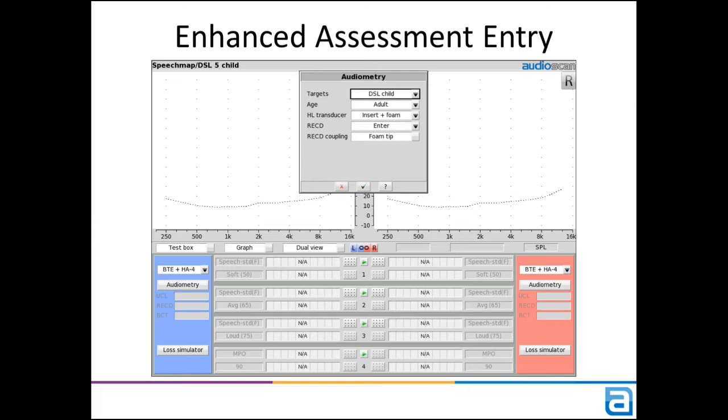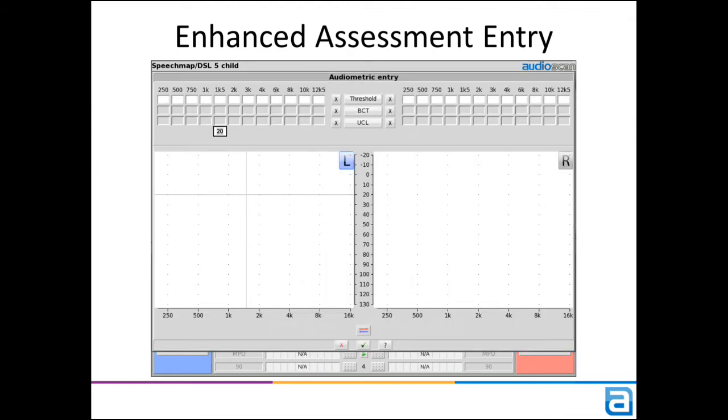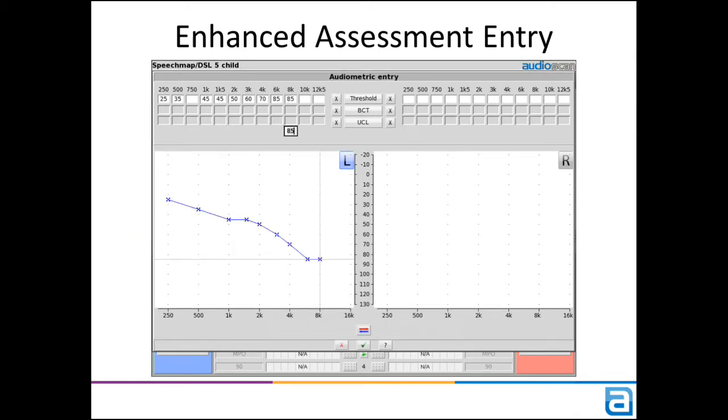However, when you click on the Continue button, you're presented with a new dual view entry screen. Click in the graph to enter an audiogram. Note that once data has been entered for one ear, this Copy button at the bottom is activated. Clicking this will copy the same curve to the opposite, empty side. This is of course a time saver for symmetric losses.